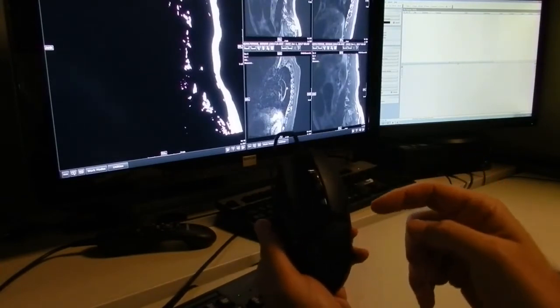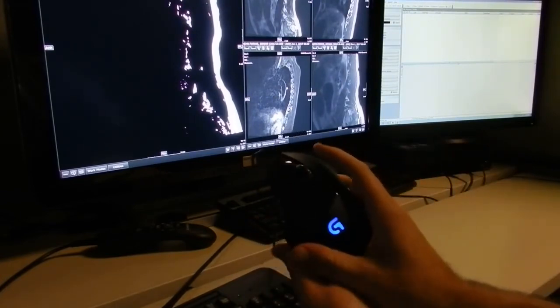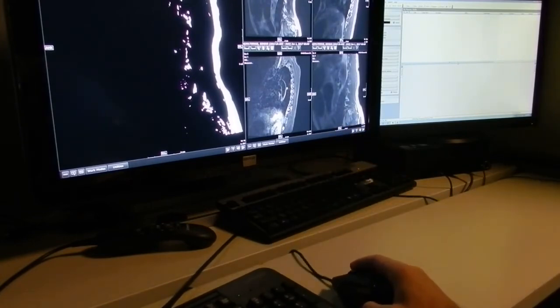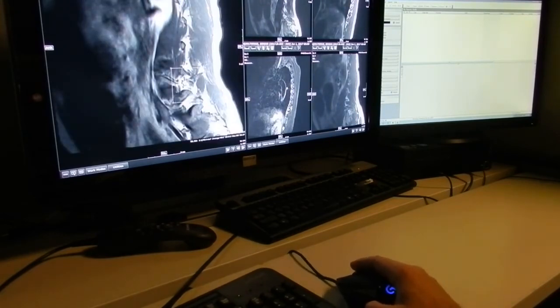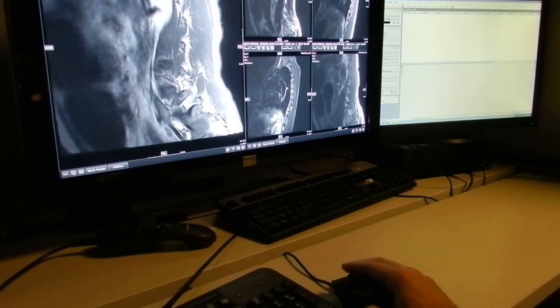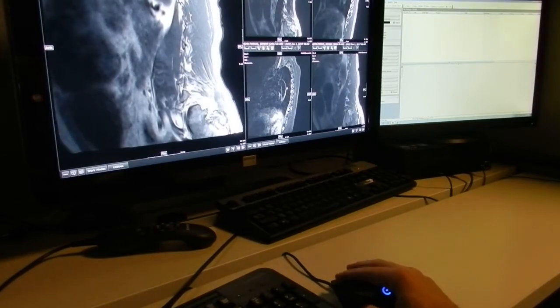The next tool is the scroll wheel left click. You're basically clicking the scroll wheel to the left. I do kind of a claw motion or a pinching motion to engage it, and what it does is it engages the ROI windowing tool. The nice thing about it is it immediately erases that stupid box that everybody hates, and then when you're in the neighborhood of where you want to be, it defaults to the normal windowing tool, which you engage with the left click, and you just get it closer to where you want it to be. So you pinch to do the ROI box, and then when you let go, it's the normal windowing tool.